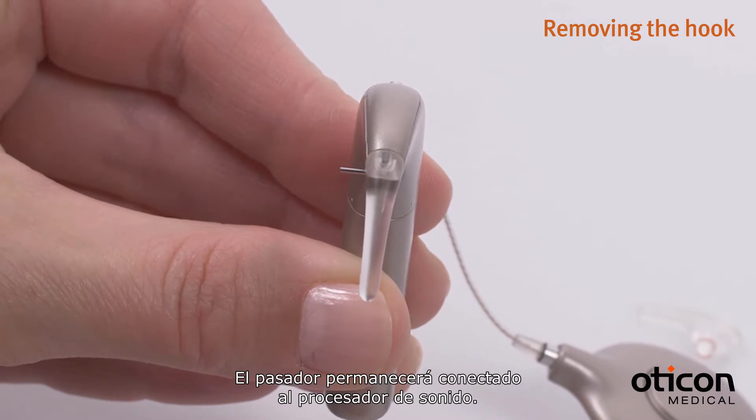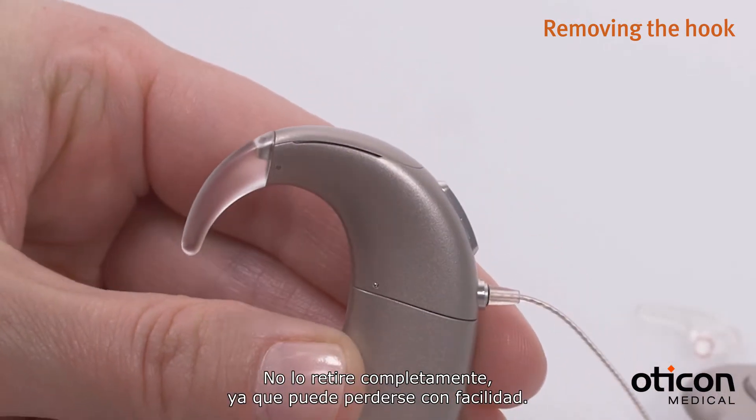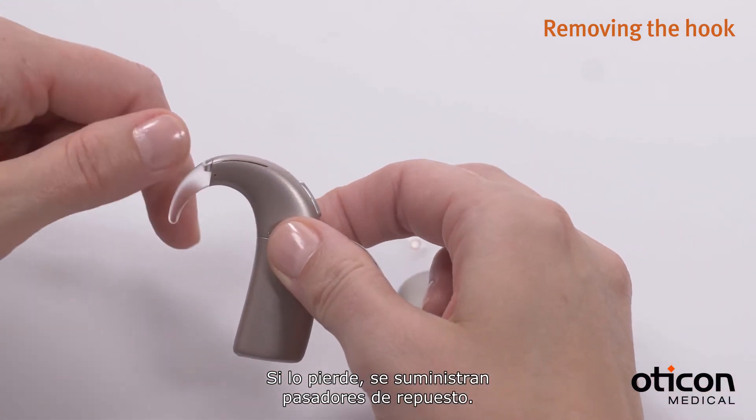The pin will stay attached to the sound processor. Do not remove it completely as it can easily get lost. If you do lose it, spare pins are provided.